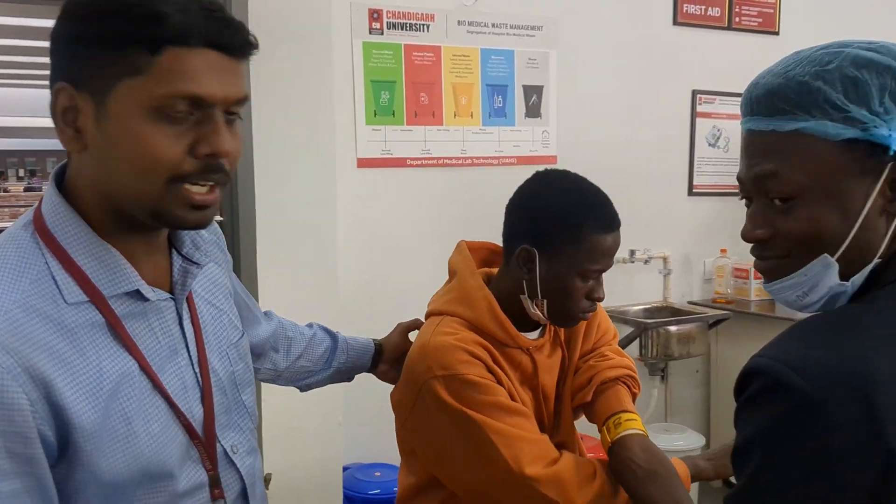Today we are performing venous blood collection, a phlebotomy technique by Mukhtar, and our donor is Abdul.